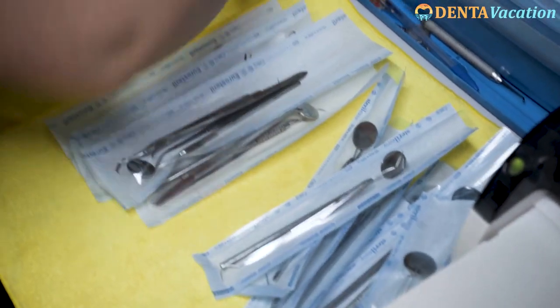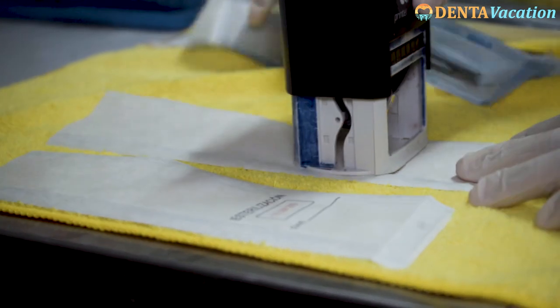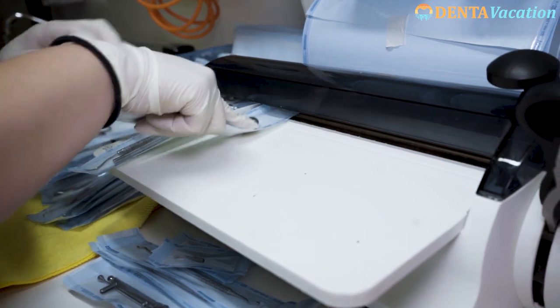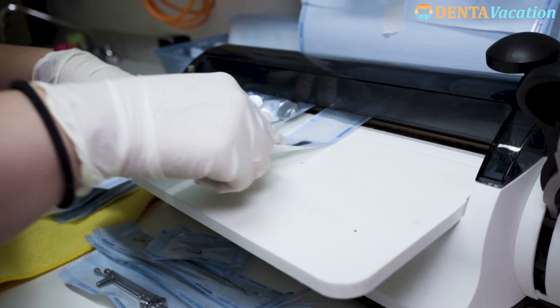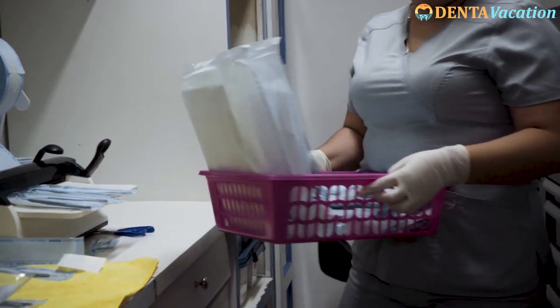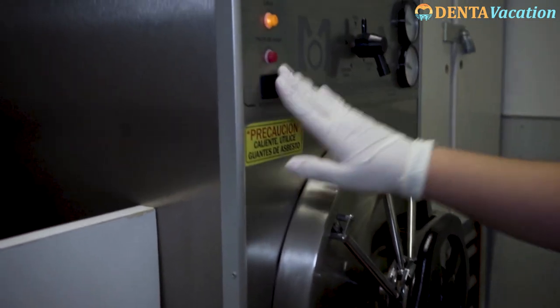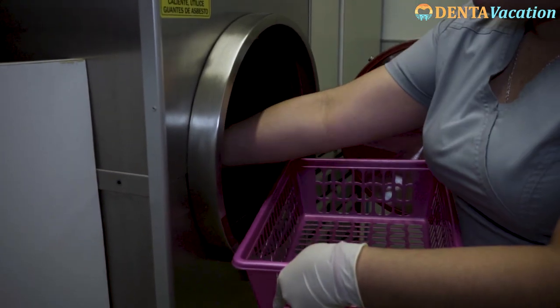The instruments are then packed in disposable paper or plastic pouches. The date of sterilization is clearly marked on the outer wrapper. These pouches have special strips built into them which change color once the sterilization cycle is complete. The packs and cassettes of instruments are then autoclaved.